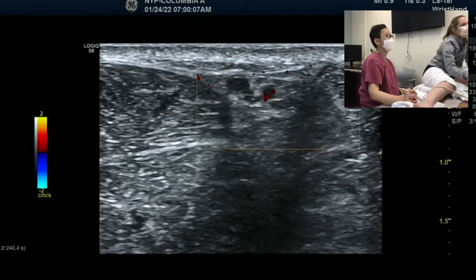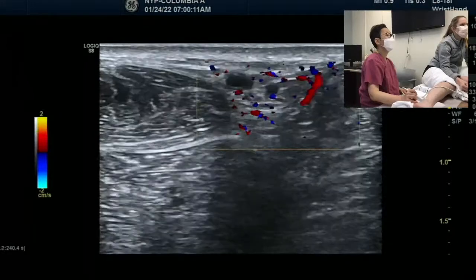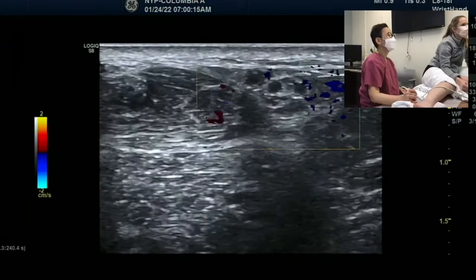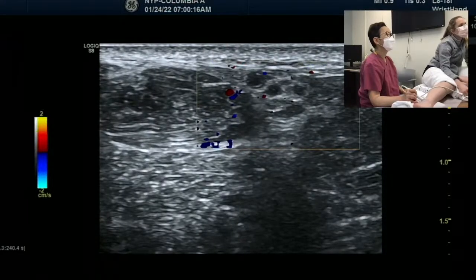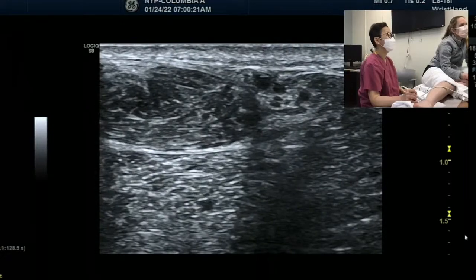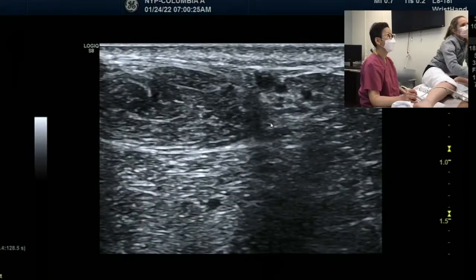See, now you can see very clearly. And then, so busy. Okay, so let's get rid of color flow. So this is almost like a sural nerve underneath of the vessels, right? Now you can see very, very clearly. Can you freeze?